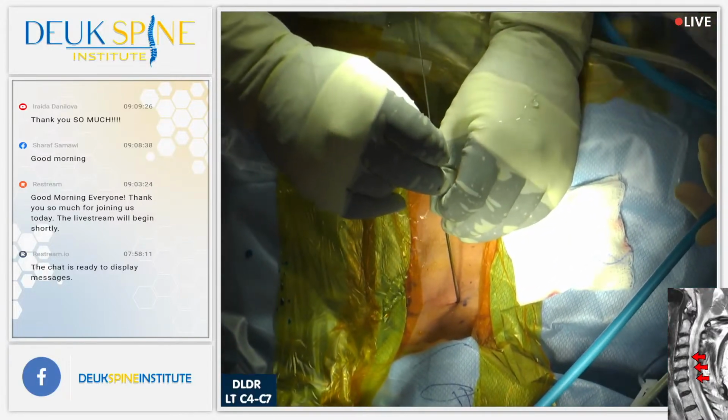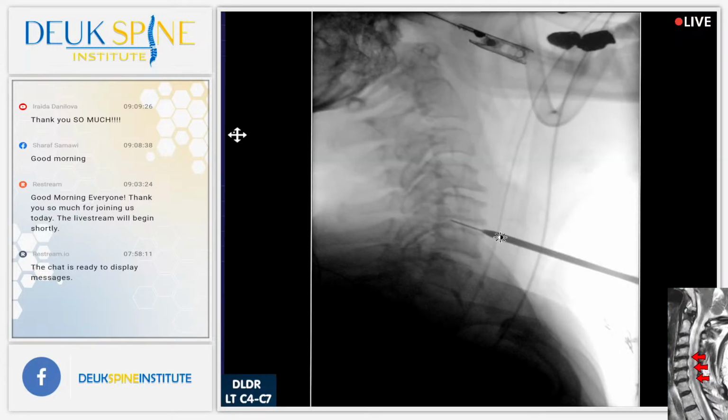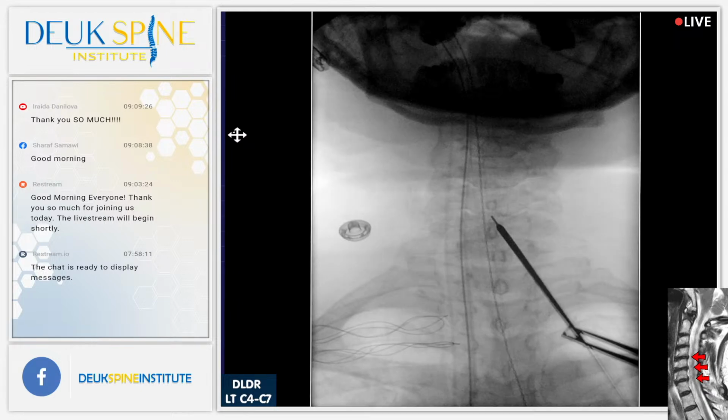All right, so I'm in the front of the spine with the dilator tip. Show us the dilator tip, Coker, and then switch to a AP. Interesting. We will need some inline traction in a moment. Not yet. We're just localizing first. We want to make sure the dilator tip enters the annulus in the front in the middle. And it is. Show us the middle. There's the center of the spine, and the dilator tip is right there, just slightly a millimeter or two eccentric to the left. All right, lateral view.